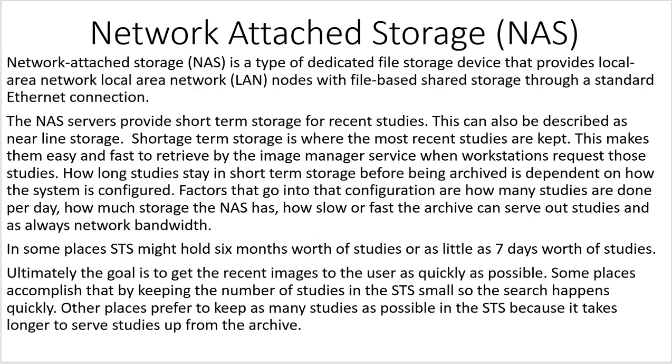The NAS servers provide short-term storage for recent studies. This can also be described as nearline storage. Short-term storage is where the most recent studies are kept. This makes them easy and fast to retrieve by the image manager service when workstations request those studies. How long studies stay in short-term storage before being archived is dependent on how the system is configured.